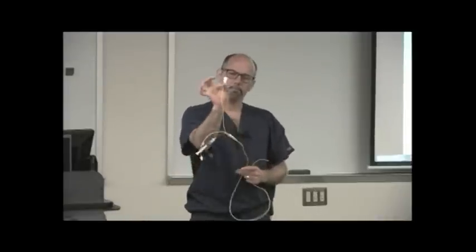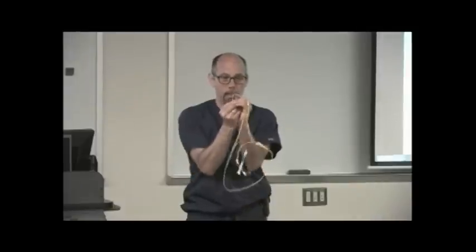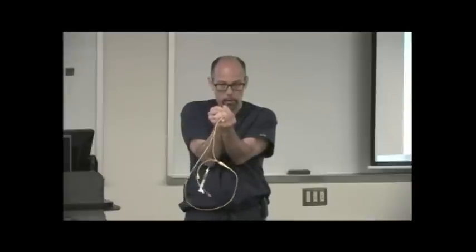It's a special syringe. It's a 3 ml syringe, but it only pulls back to 1.5 mLs. That's because that balloon holds 1.5 mLs. No more, no less. All right? Well, it can hold less, but its maximum is 1.5. The other connection on here is a thermometer. It's called a thermistor. It gets connected to a temperature cable that goes to your monitor. It is reading the temperature at the tip of the catheter. So at the tip of the catheter, I have a balloon, I have a lumen that opens up that I can transduce, and I have a temperature cable.